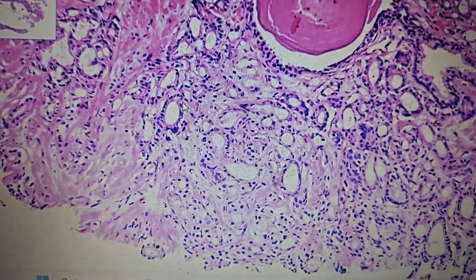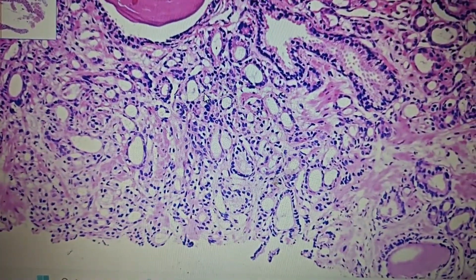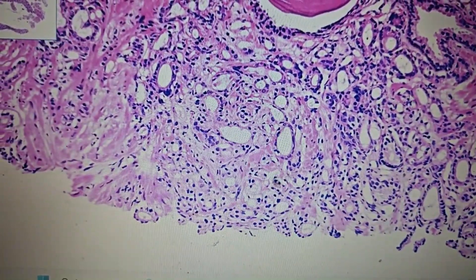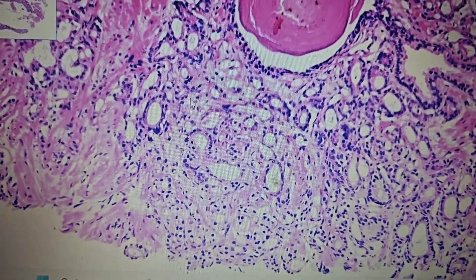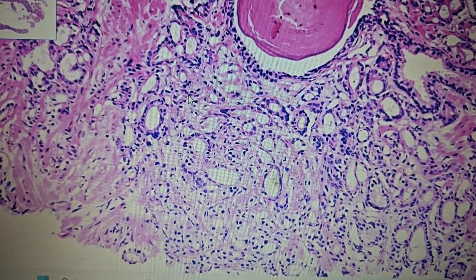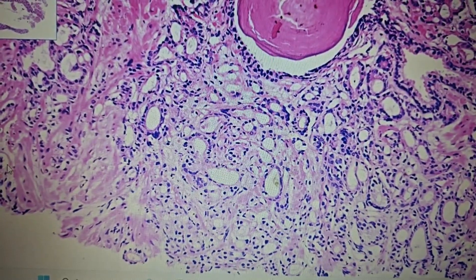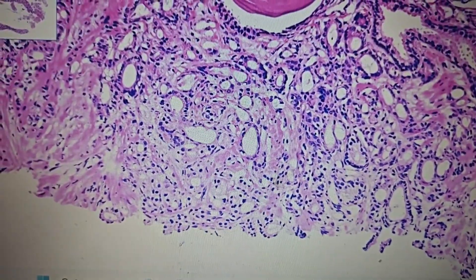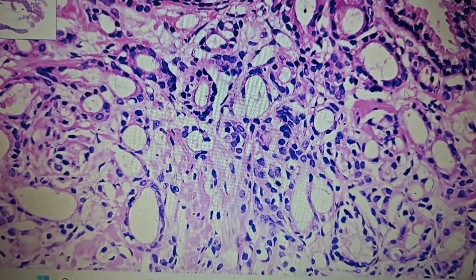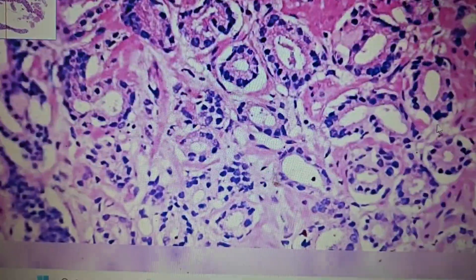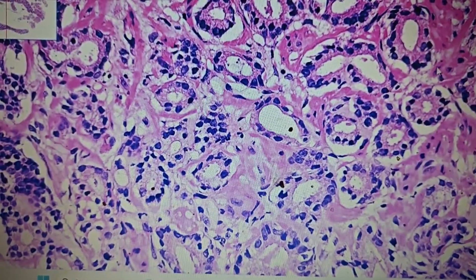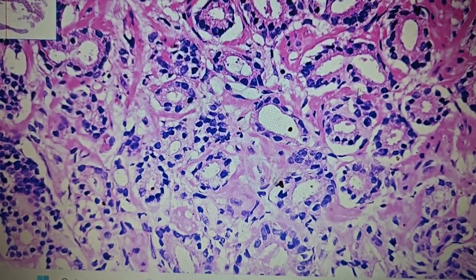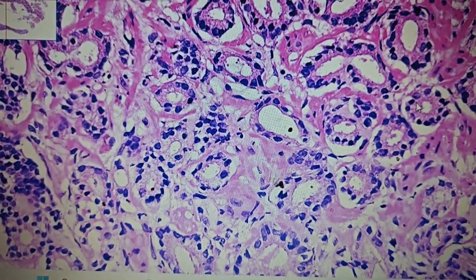The next important step after identifying prostatic adenocarcinoma is to understand the pattern of the glands to perform Gleason scoring and grading. In the Gleason system, there are five patterns. In pattern 1 or 2, the tumor is well circumscribed consisting of discrete regular glands. In pattern 3, as seen here, there are discrete glands with some intervening stroma. These are crowded glands lined by single-layered epithelium with intervening stroma between them.